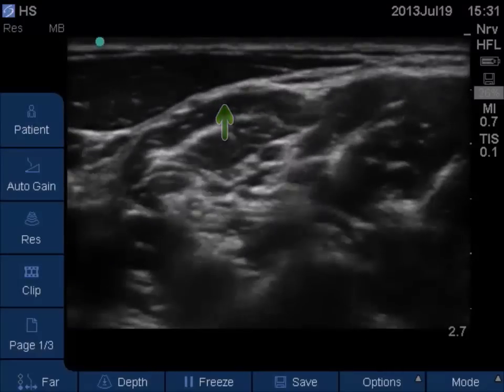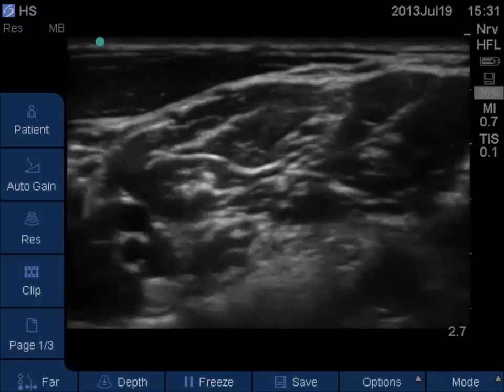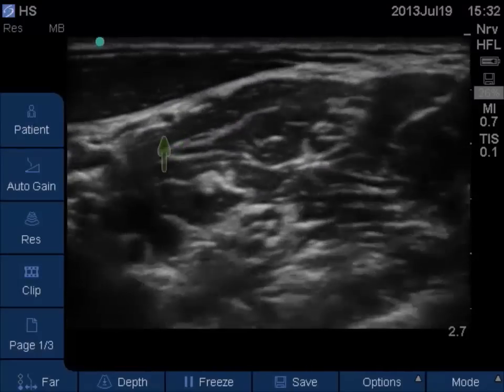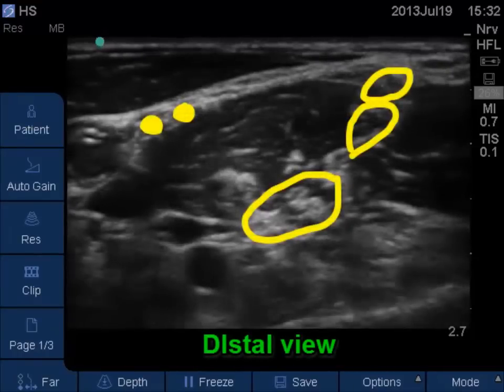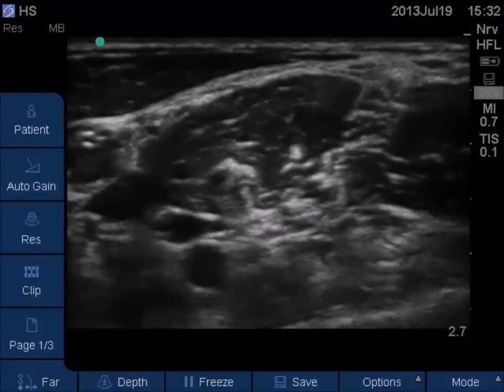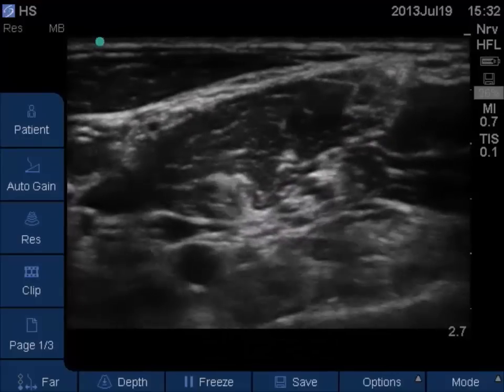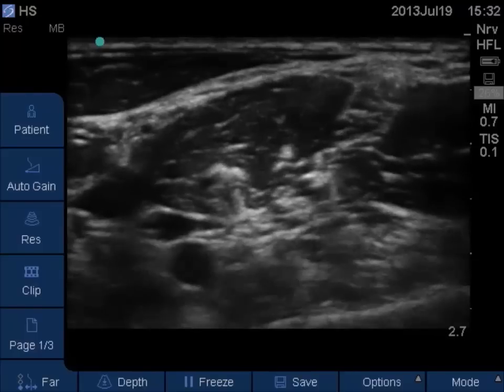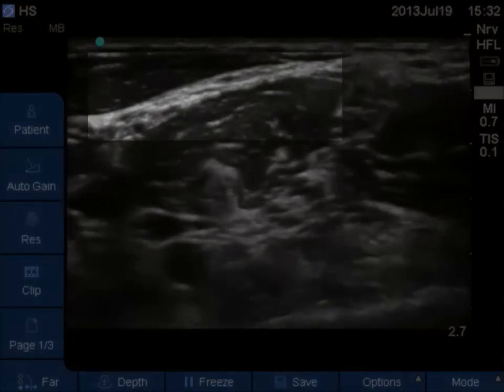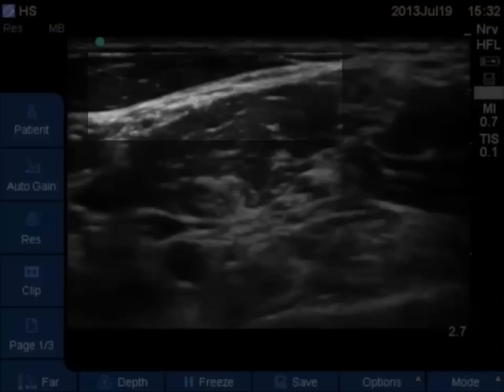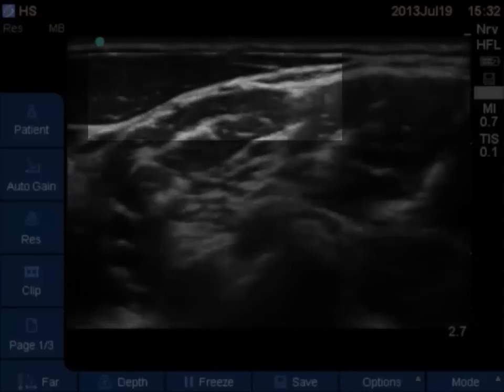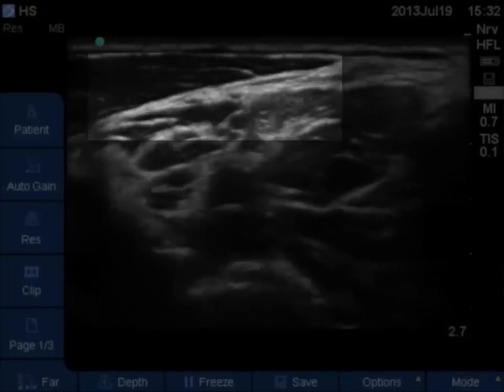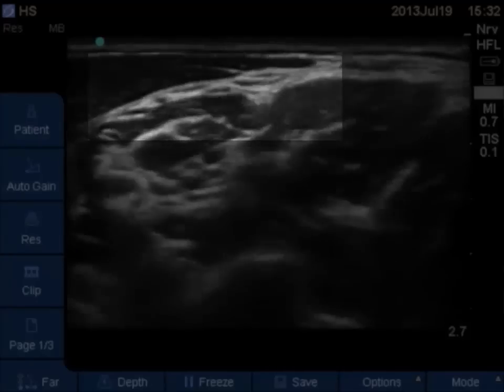As we move the probe distally again, we find that the phrenic nerve lies on the anterior boundary of the anterior scalene muscle and can be seen moving from a more lateral direction to a more medial direction as we go distally. Notice the area anterior to the anterior scalene and you may be able to see two hypoechoic shadows moving medially and laterally at the corresponding levels.